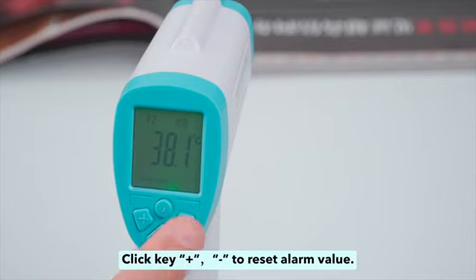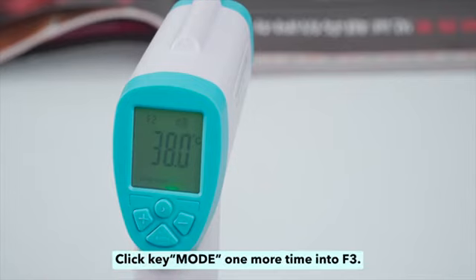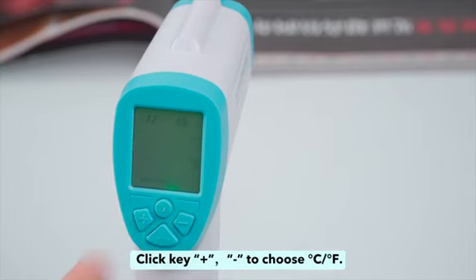Click plus or minus to reset the alarm value. Click key mode one more time to enter F3. Click plus or minus to choose Celsius.